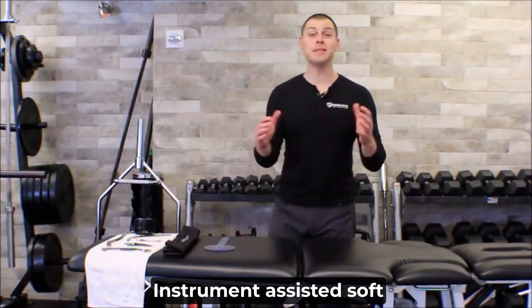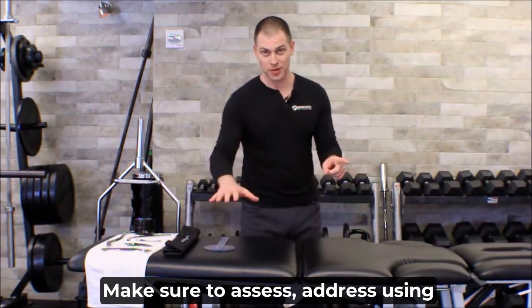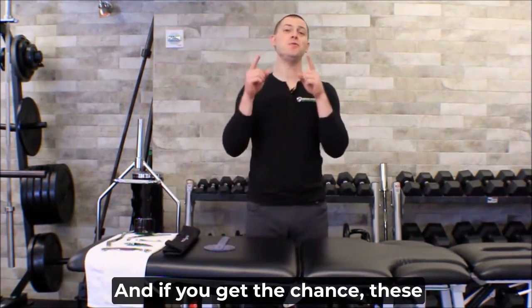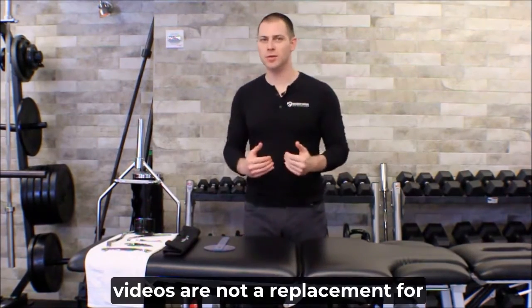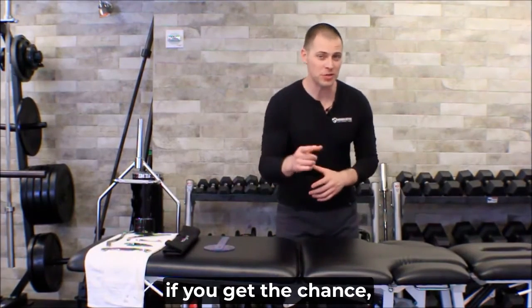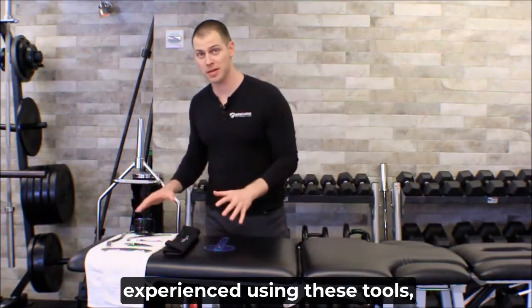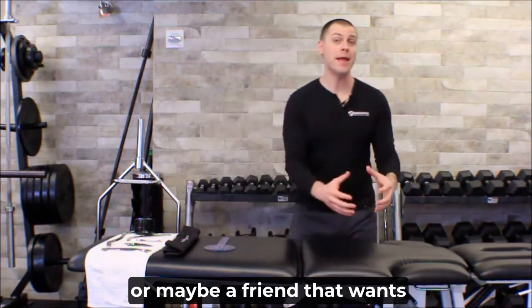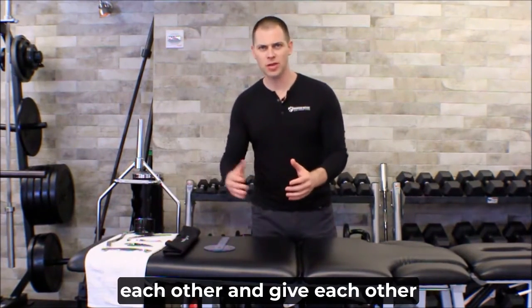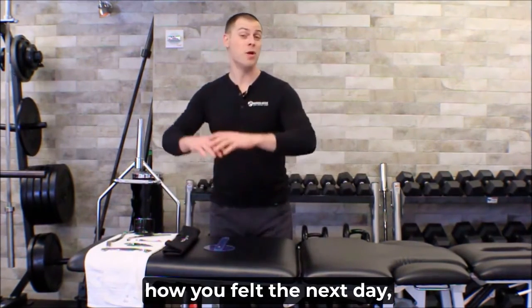So there you have it, instrument-assisted soft tissue mobilization. Make sure to assess, address using the intervention, and then of course reassess. And if you get the chance, these videos are not a replacement for live education. Of course, if you get the chance, you should take live workshops or find a mentor who's experienced using these tools, or maybe a friend that wants to learn them too, so at least you can practice on each other and give each other some tactile feedback of what you feel, how you felt the next day, what results you felt that you got.